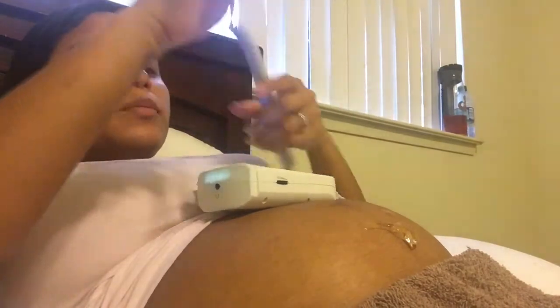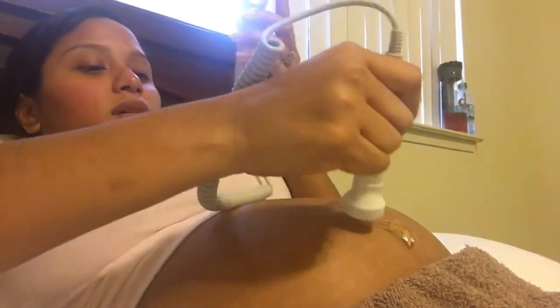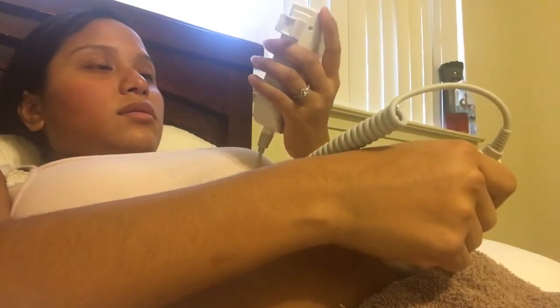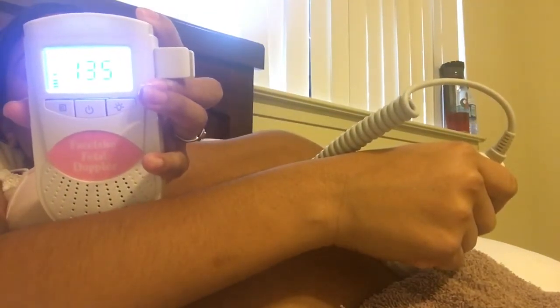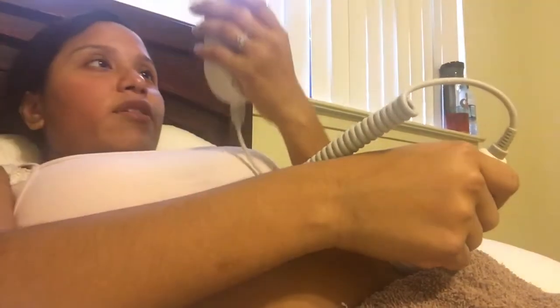I'm going to try to look for her heartbeat — just give me a second, I've got to hold it right. Here's my little monitor and probe. It's a little loud! That's her heartbeat right there — it's 135 beats per minute.